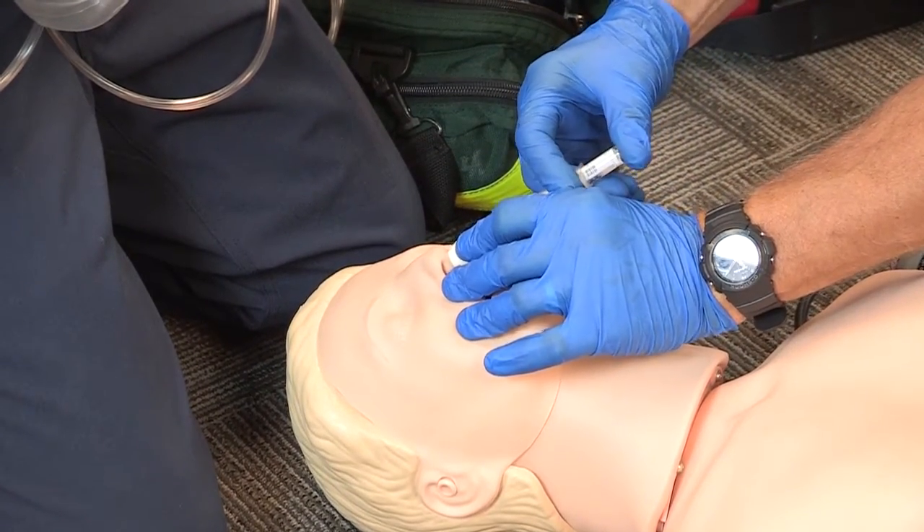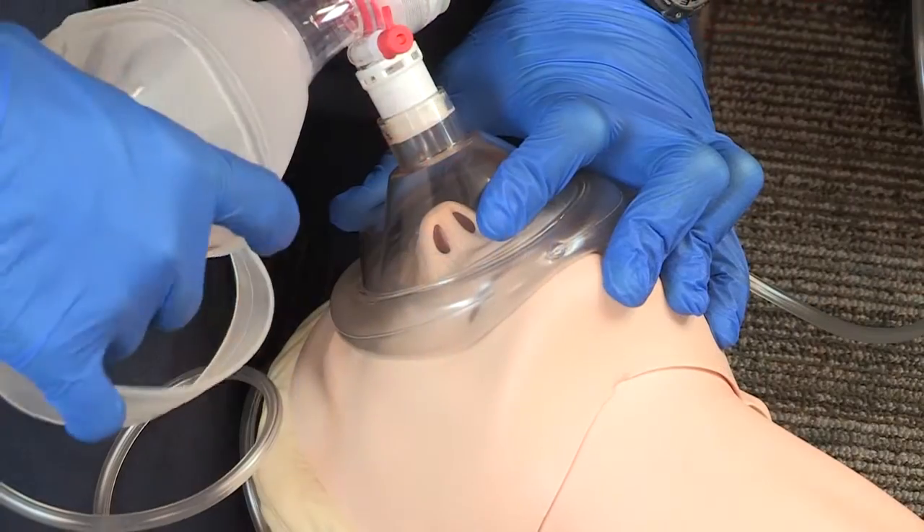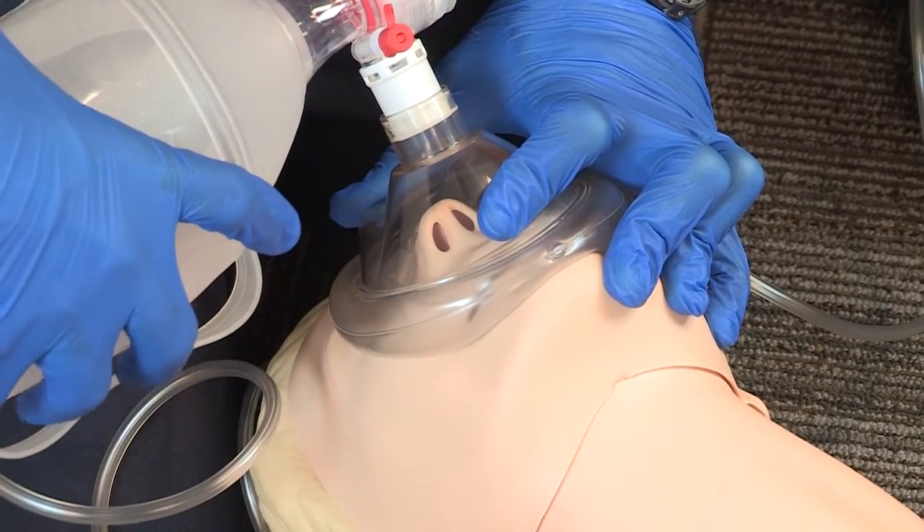Our emphasis is going to be on patient assessment, ABCs, and ventilating these patients using a bag valve mask.